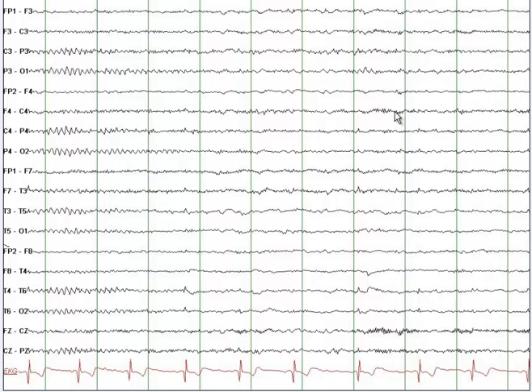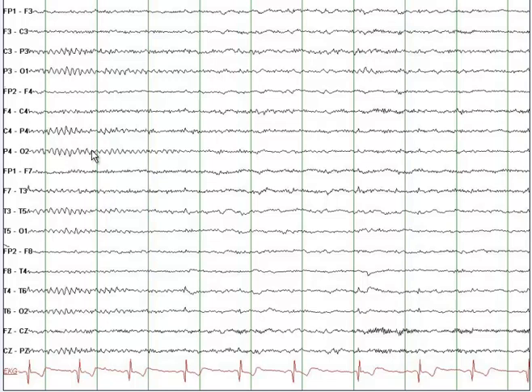Some additional features: the fast frequencies you see here are very tiny waves at a very fast frequency. If you count 13 or more waves in one second, that qualifies as beta frequency. Beta frequency starts from 13 Hz and goes higher. If there are 8 to 13 waves in one second, you call it alpha frequency. If there are 4 to 7 waves in one second, you call it theta frequency. If there are less than 4 waves in one second, you call it delta frequency.